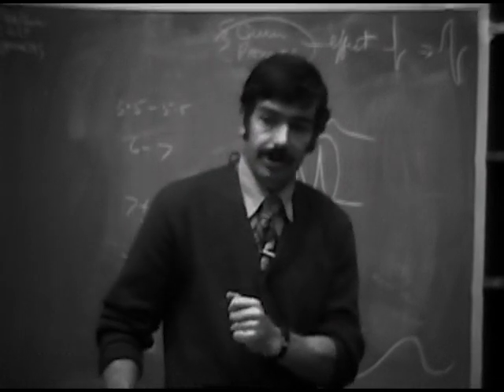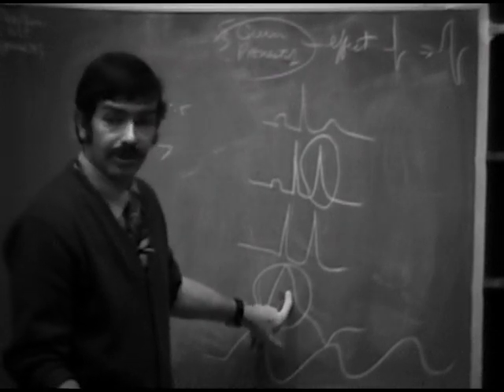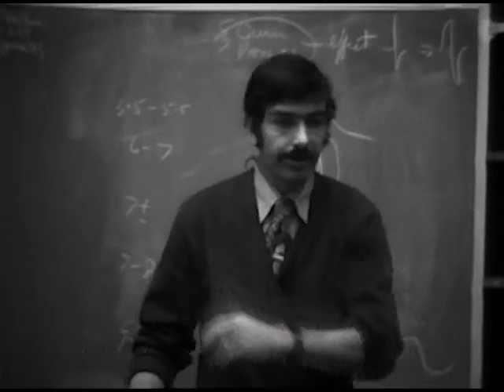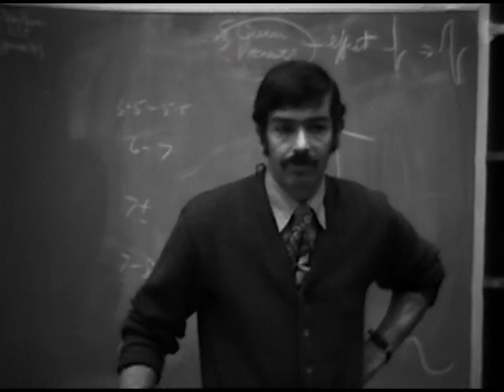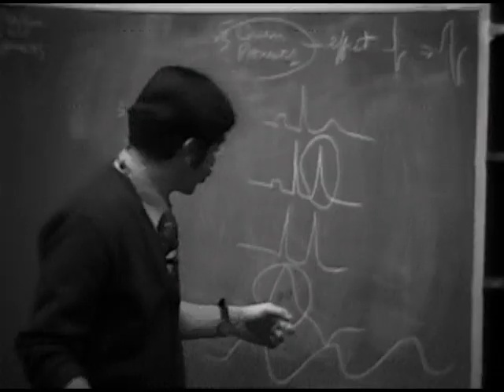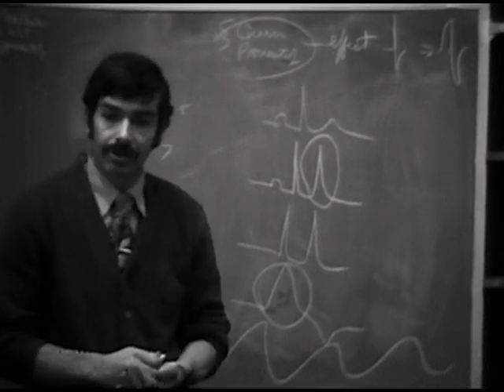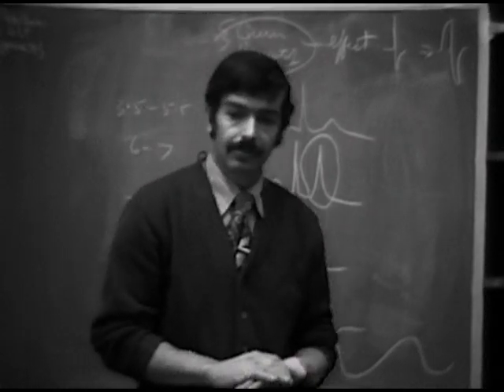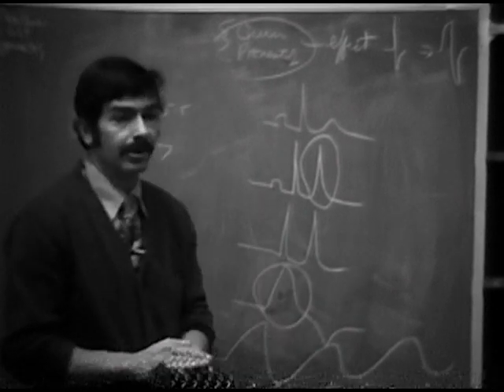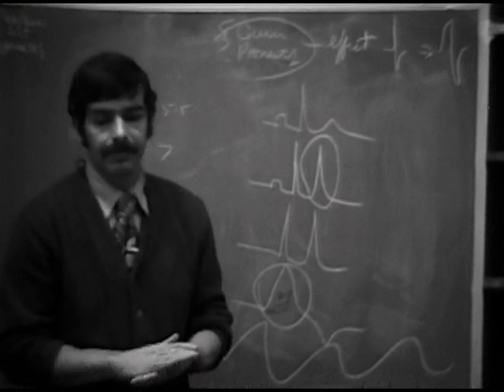Whereas in this situation, it looks like complete heart block with idioventricular rhythm, except the rate is surprisingly normal. It may be slow around 60 as well, though, but it's generally faster than the complete heart block range. So that may be a tip-off.